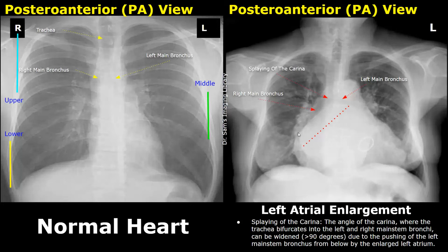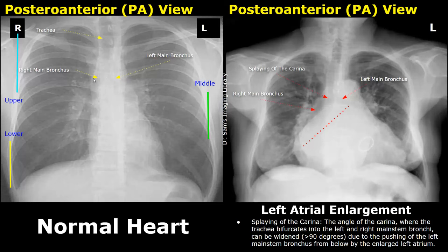Another feature that may be seen in significant left atrial enlargement is the splaying of the carina. The carina is the junction where the trachea bifurcates into right and left main bronchi. Normally the angle should not be more than 90 degrees. The enlarged left atrium pushes the left main bronchus upwards, leading to splaying of the carina.